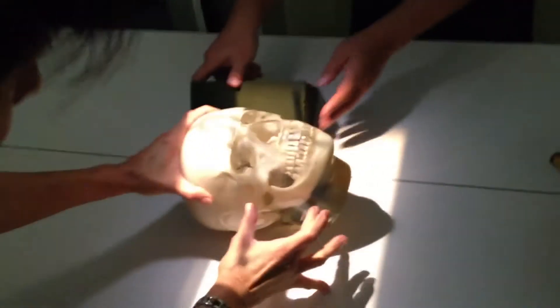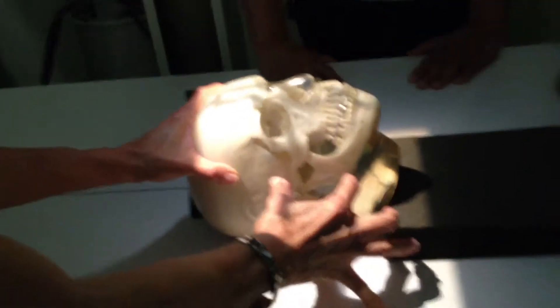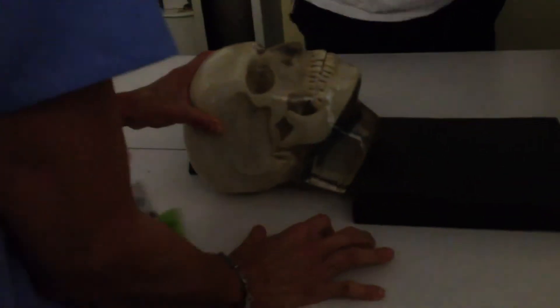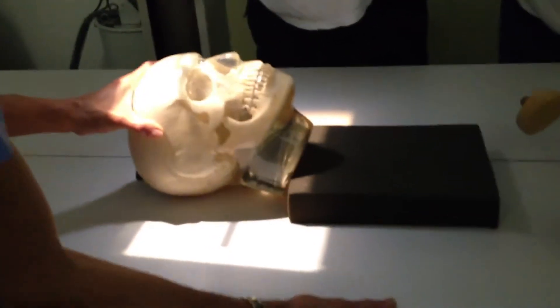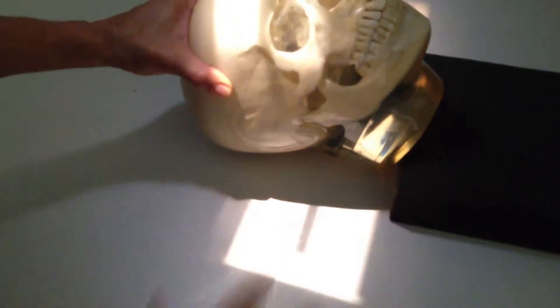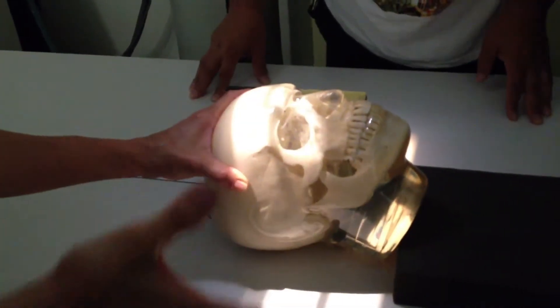It doesn't matter to me where I'm going, but this is what I want on a town view. I want from here to here. I want to slide it down. Let's go with the T into... And then I just collimate. Not that much — open it up a little bit. Because someone did a town and I ended up with a lot of skull, but right now you're going to get a beautiful collimated image.